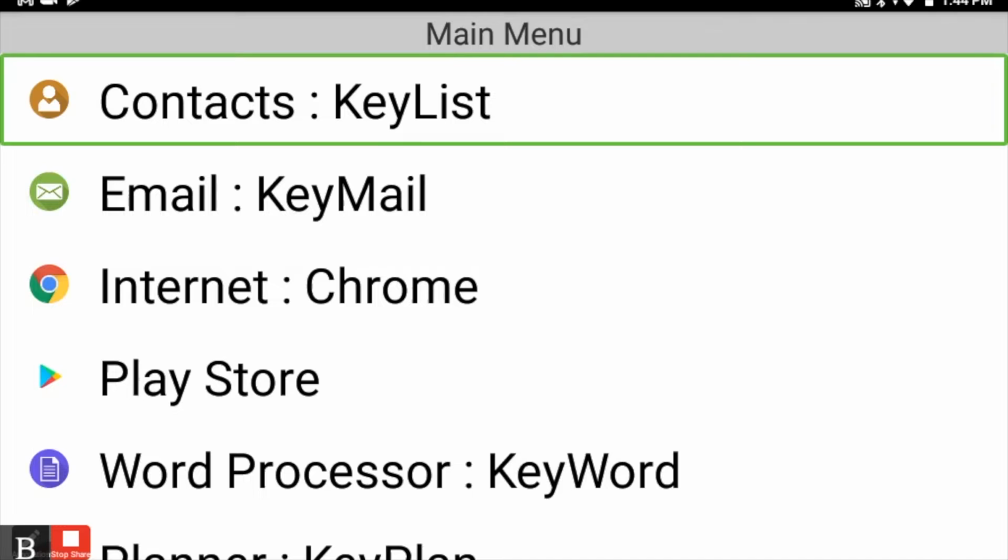Because of Humanware's software that they're running on this, called Keysoft, they've essentially made it so that everything on the device acts as if it were a vertical list. I am sharing my screen for the purpose of this video too, so you can follow along visually. There's going to be a green highlighter bar that highlights my cursor position, or where I'm at on the device, visually anyway. And on my Braille display, I'll have Braille wherever I am, as well as speech echo back.